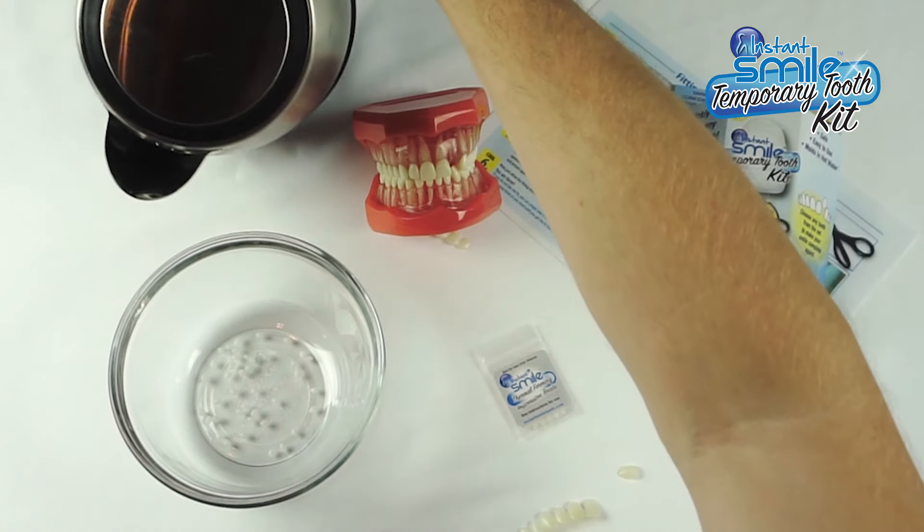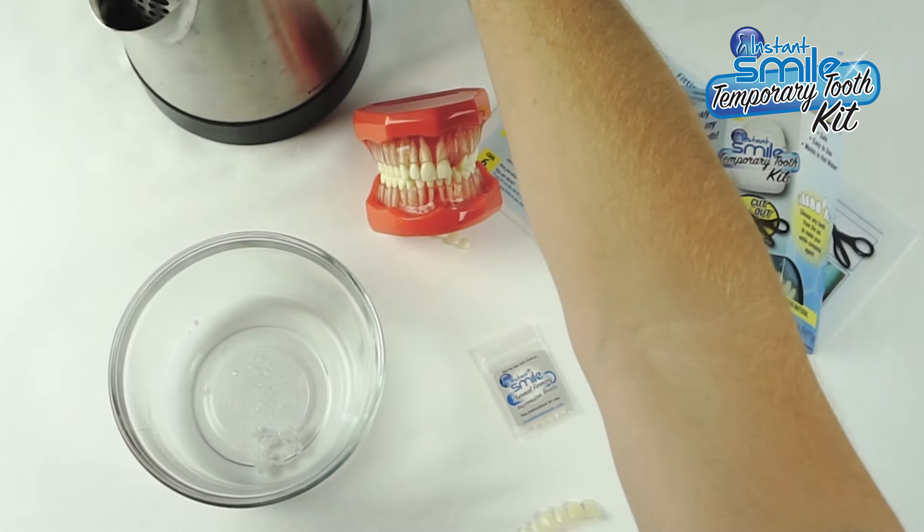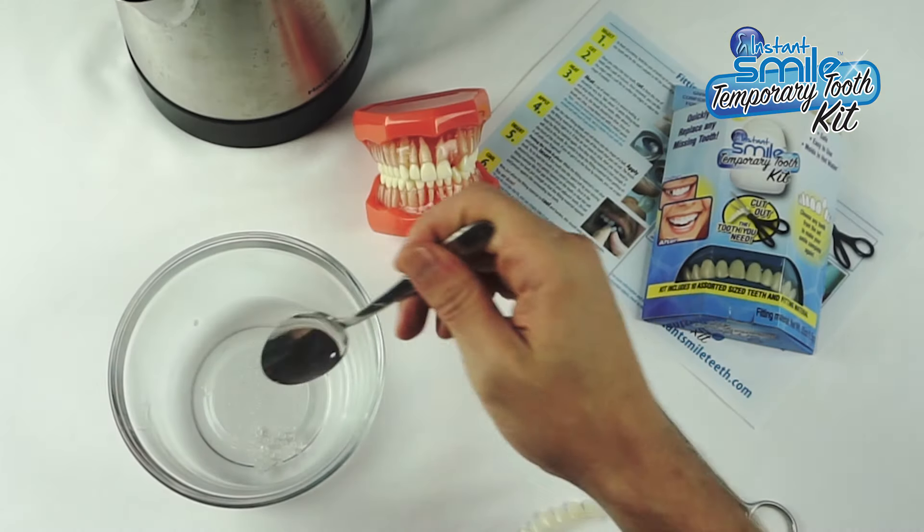Pour about half of your fitting beads into a cup of very hot water. The water should be simmering or recently boiled. If the water is hot enough, it only takes a few moments for the beads to turn clear and become soft and pliable.